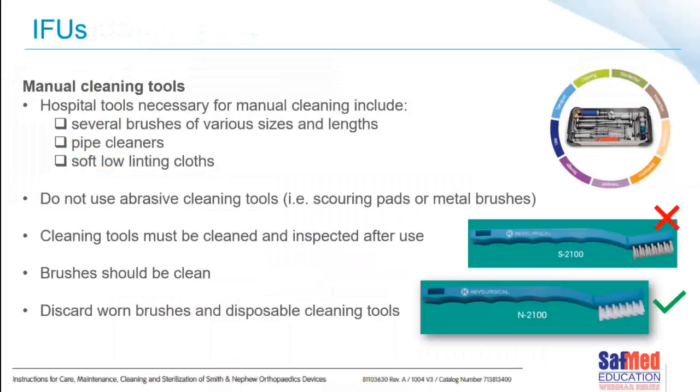So we're going to use this set of instructions for use as an example. It's from some orthopedic devices from one of the suppliers that we know of instruments and devices that we use in the country. Certainly this one focused on instruments used for hip and knee replacements. So these are orthopedic complex devices. I'm sure that you've worked with them before and know how complex they are. Here's what the instructions for use started with.